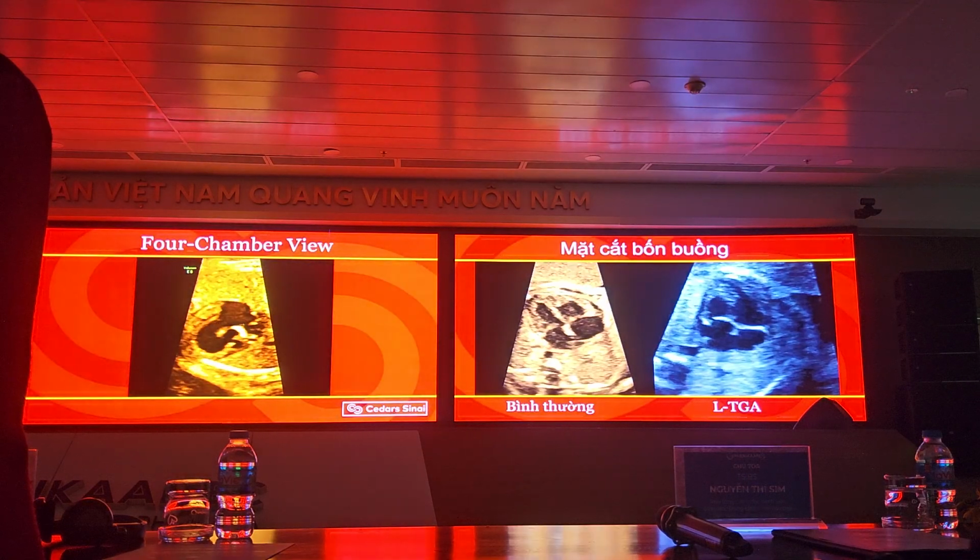Again, the four-chamber view, spine is over here. This is a hypoplastic right ventricle that's posterior, and we have a very dilated left ventricle that's anterior. You notice a mitral valve because there's no attachments to the septum, and you can see the VSD.